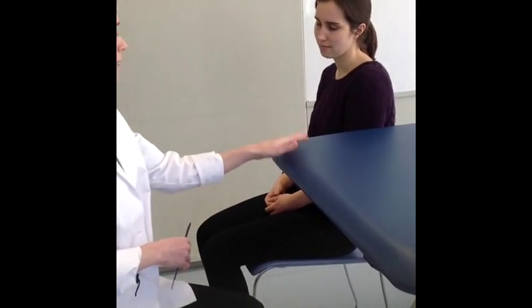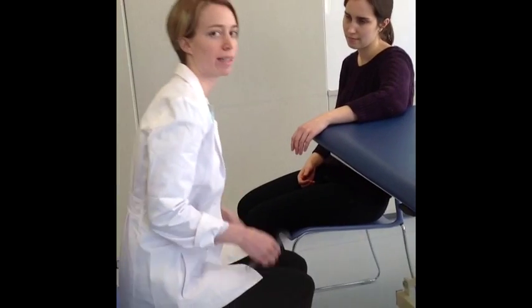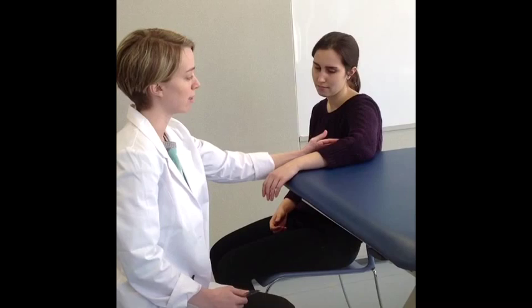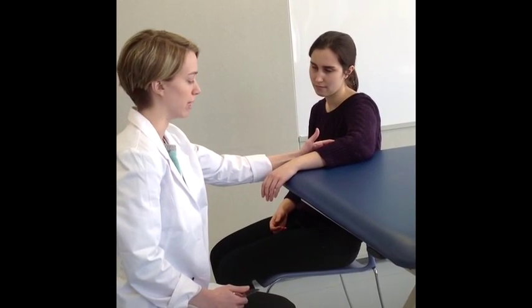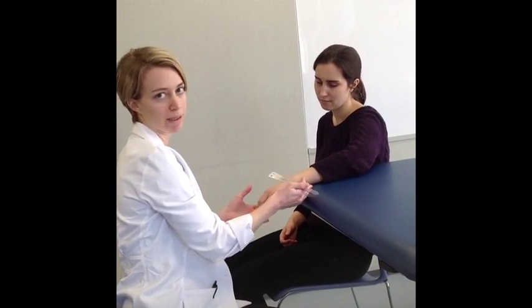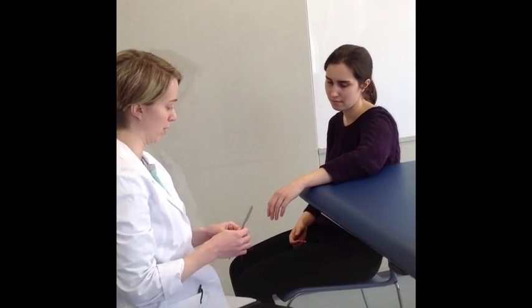So now we're going to talk about how to measure wrist flexion using a goniometer. In terms of patient and therapist positioning, you're going to have the patient just seated next to a table, and as a therapist you can also be seated for better body mechanics. You're just going to ask the patient to put their arm up on the table. The shoulder should be at about 90 degrees of abduction, and the elbow should be flexed to about 90 degrees. You're going to move forward a little bit so the wrist is off the table so you can get through that full range of motion.